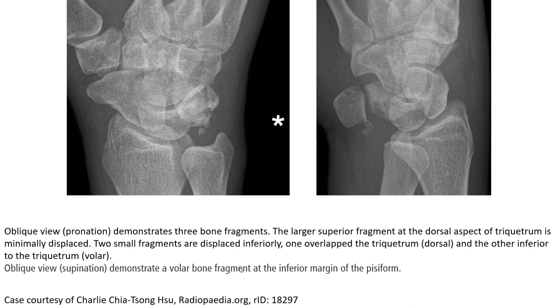Two small fragments are displaced; one overlaps the triquetrum and the other is inferior to the triquetrum overlay. The oblique view demonstrates a volar bone fragment at the inferior margin of the pisiform joint.